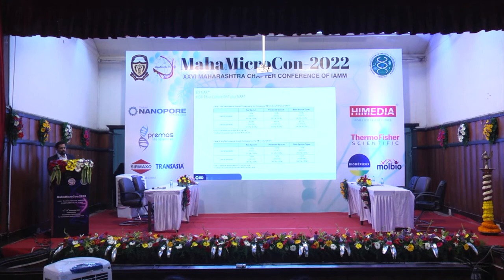Now when we see the performance for RIF resistance as well as INH resistance, the overall sensitivity for RIF resistance was 100% in both types of sputum, while the specificity was 99.5% for raw sputum and 96.8% for processed sputum. And when we see the INH performance, the overall sensitivity was 100% for both sputum types, and the specificity was also 100%. So it had a good sensitivity and specificity for INH.